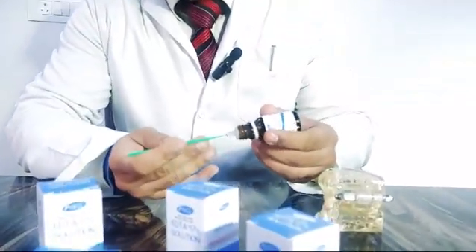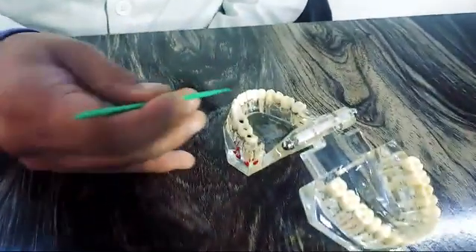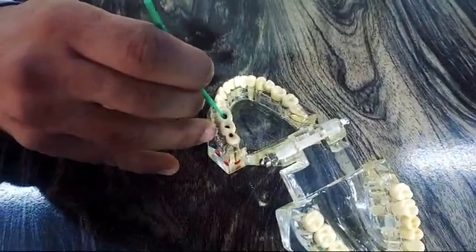you can use it with the applicator tip — job is done. It is very easy in handling characteristics, and dispensing is very easy. Once you have prepared your access cavity and the dental cavity preparation is done, you can use this product to remove the smear layer and other debris wonderfully.